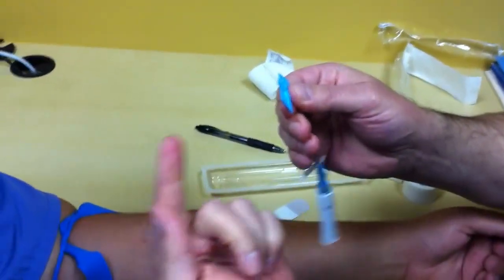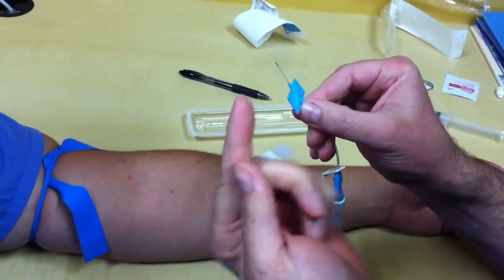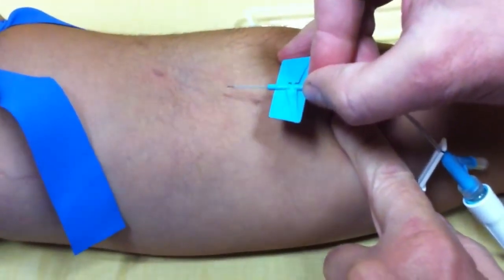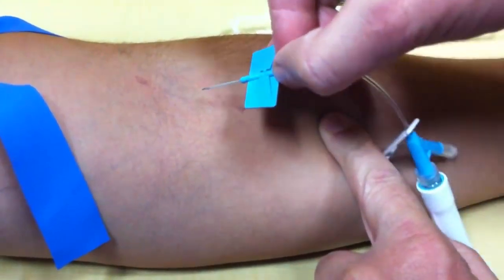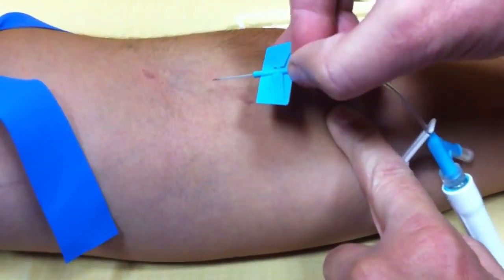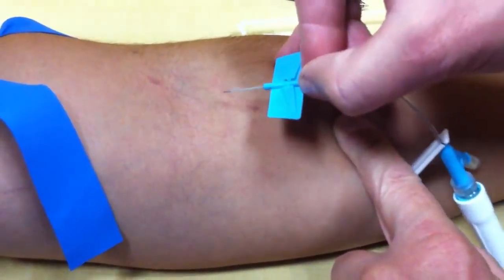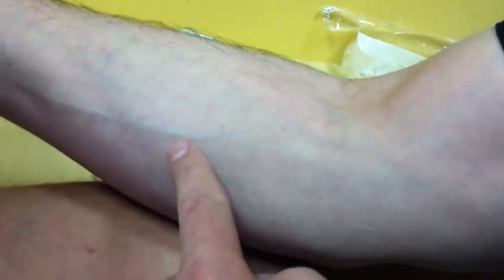Expose your needle and make sure the bevel is up. If you look at it real closely, you'll see the bevel's up. We're going to go in at an angle. Depending on how much tissue you have to go through is going to depend on the angle. If the patient has a lot of tissue and you cannot see the vein, we're going to go at a steeper angle. If your veins are visible, you're going to go at a more shallow angle.